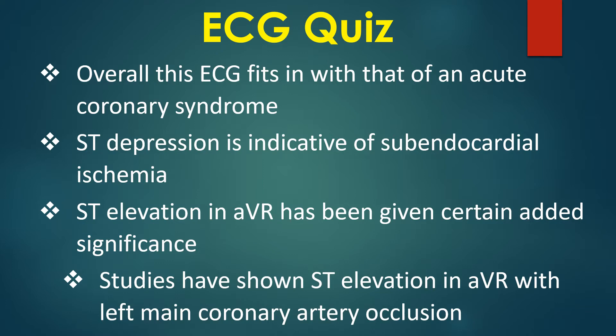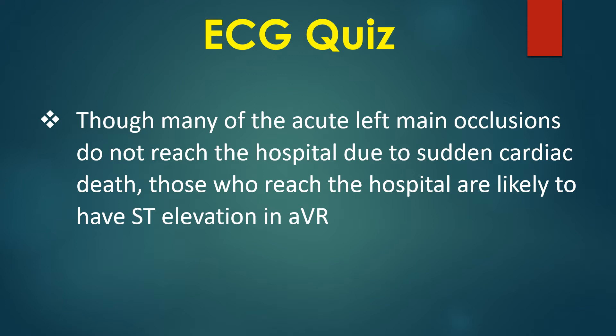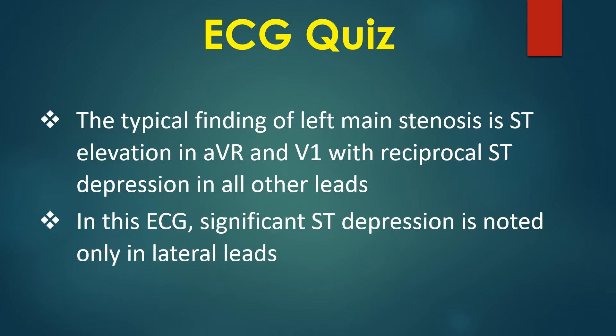Studies have shown ST elevation in AVR to be associated with left main coronary artery occlusion. Though many acute left main occlusions do not reach the hospital due to sudden cardiac death, those who do are likely to have ST elevation in AVR. The typical finding of left main stenosis is ST elevation in AVR and V1 with reciprocal ST depression in all other leads.